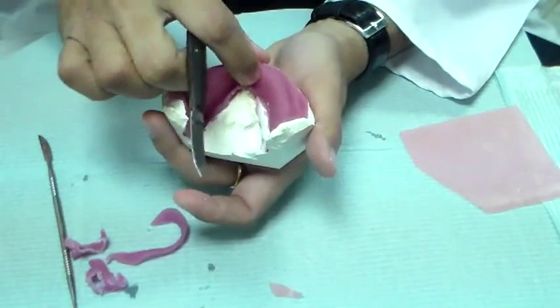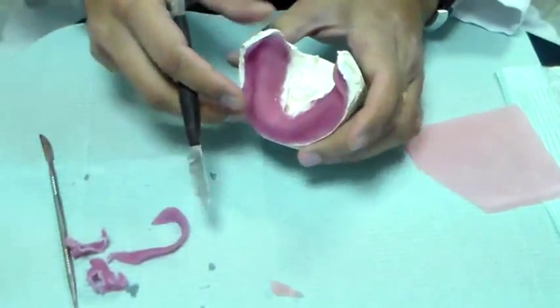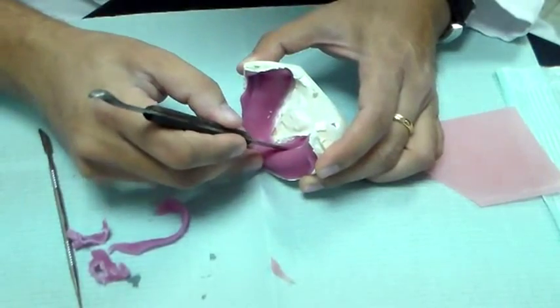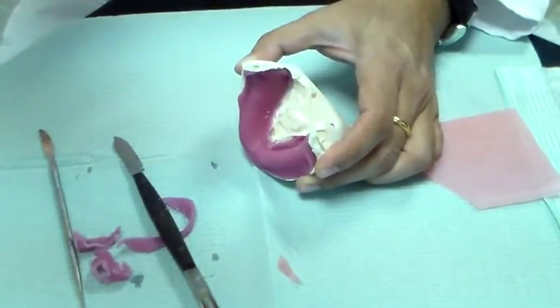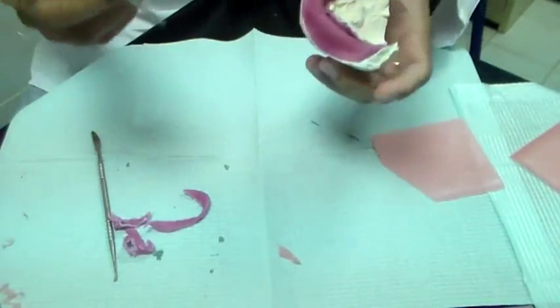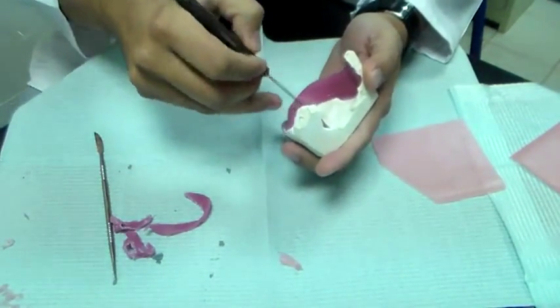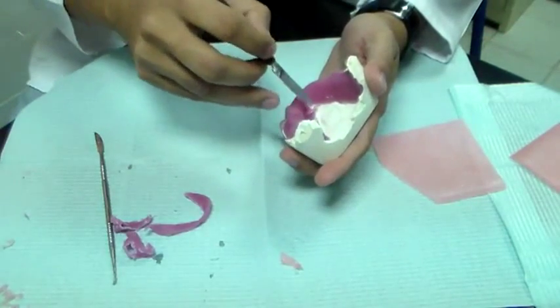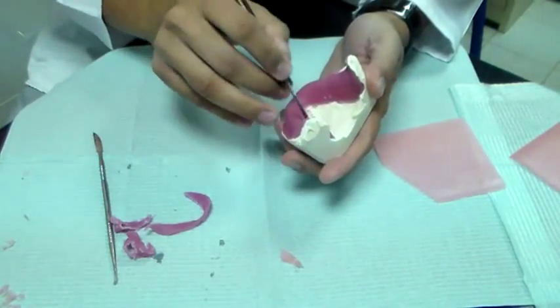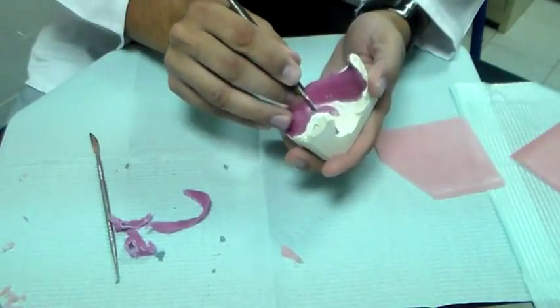I seem to have torn this, but with light cure you can always build it back — so that's really good. We're back here removing this material off from the inner portion, and we want to stick to the extension of our green line. I'm taking off all my acrylic resin from there.